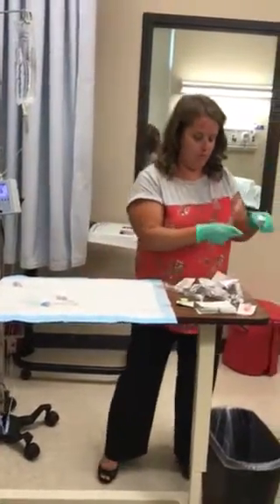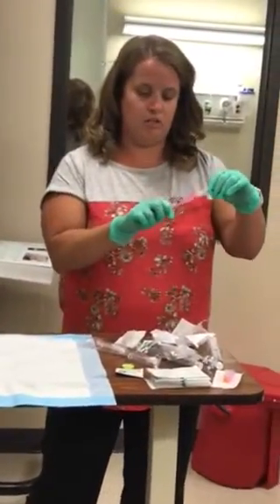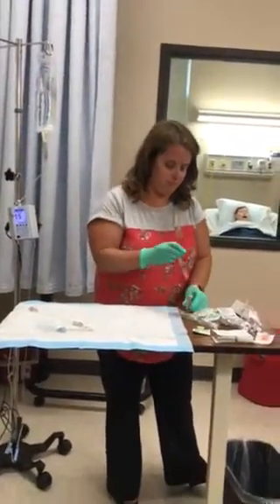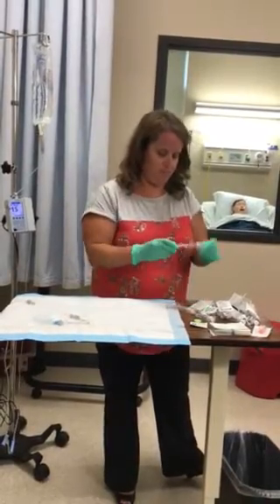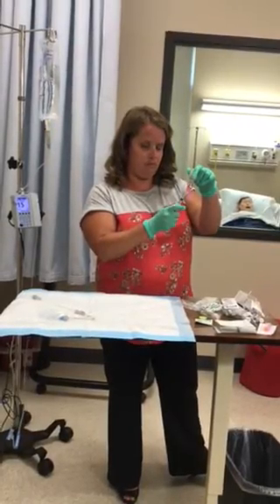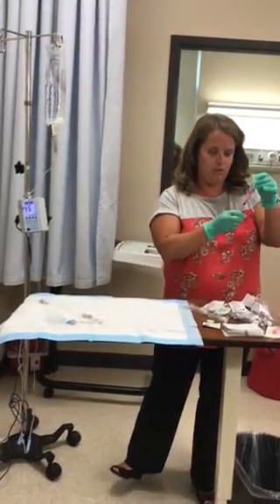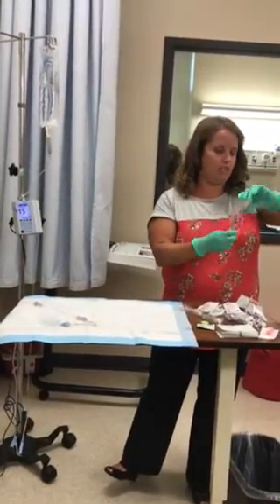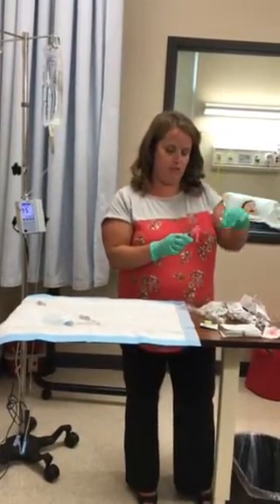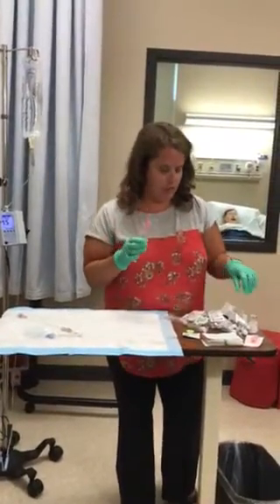You're going to scrub to prevent infection. So our seconds over the line: 120 seconds and I have 10 lines for one ml. So 120 divided by 10 is 12, and you want to round up to a nice even number on your watch, so you round up by five. So if it's 12 seconds, I'd round up to 15. So I'm going to push this medication evenly distributed, 15 seconds a line.